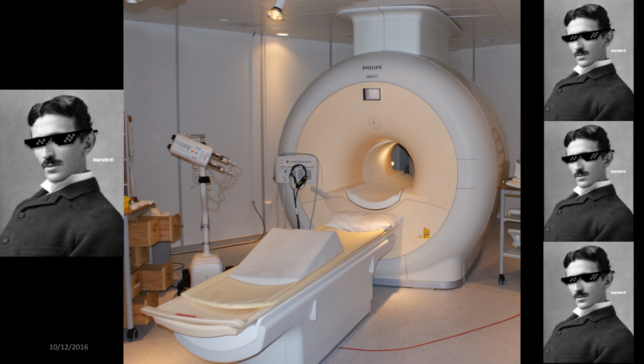So MRI uses a giant superconducting magnet. Let's get the laser pointer going. This is the superconducting magnet inside here. It's encased inside of liquid helium, and the reason being, liquid helium, as a liquid, is down to almost absolute 0 Kelvin. What this does is allow the wires inside here to superconduct. It means they have 0 resistivity, or 0 ohms, and it means that it can generate absolutely monstrous magnetic field strengths. So that's how that internal part works.